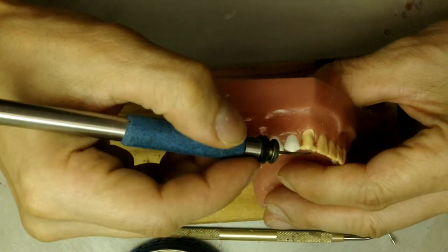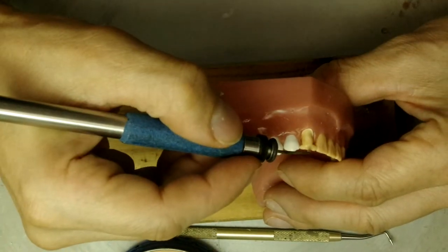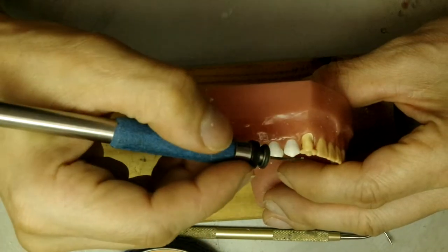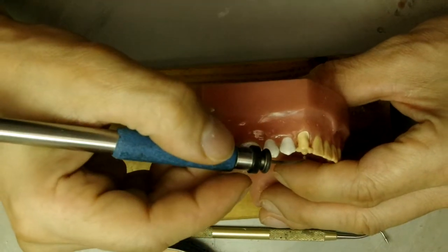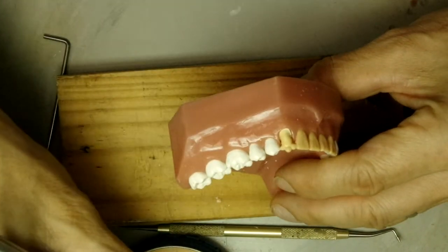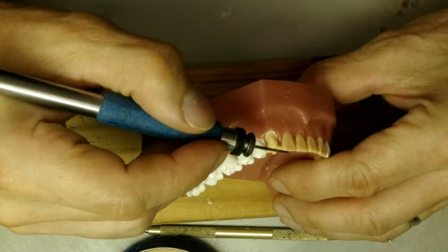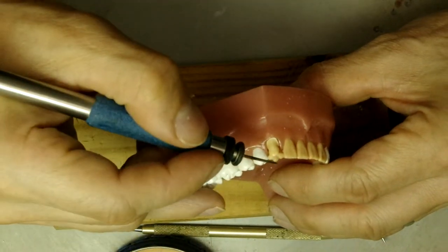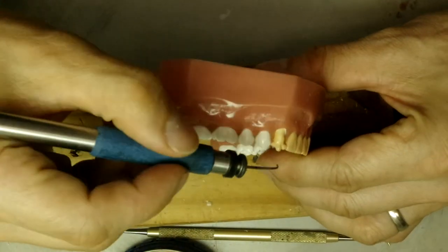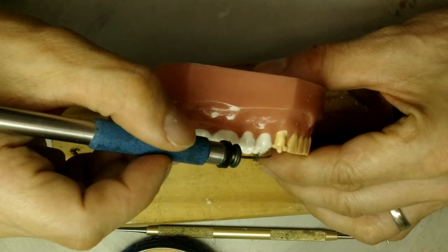So we're gonna put the cusp tip a little bit to the mesial. And we're going to try to line it up with the mandibular first premolar. So these are not going to be too much longer. These should be about the same length as the first premolar, and kind of line up maybe a little bit higher than the incisors. So this cusp ridge that we're going to build is going to be shorter than the distal cusp ridge here.